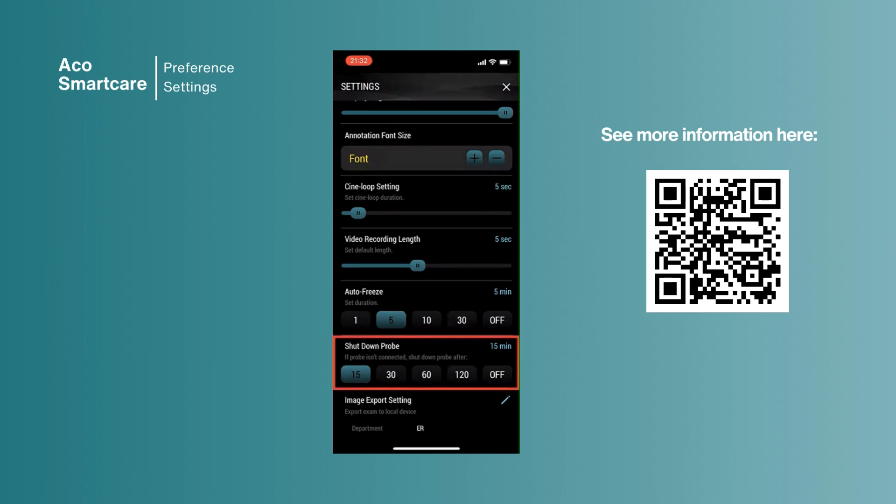The system also has an option for users to set up an auto shutdown probe setting, allowing probes to shut down from 15 minutes to 120 minutes or simply just tap off. This function is to extend battery lifetime for the probe.